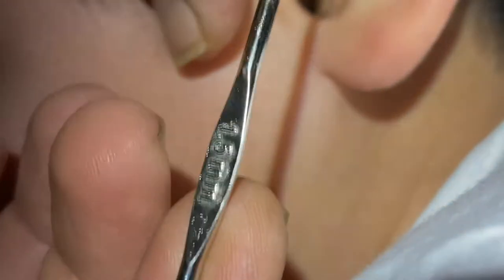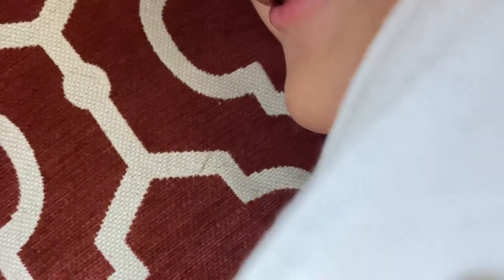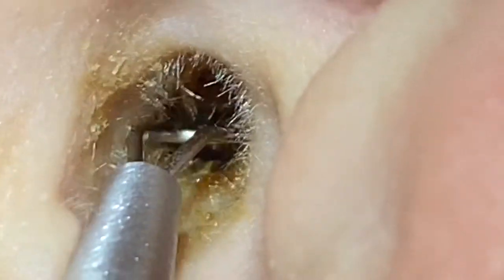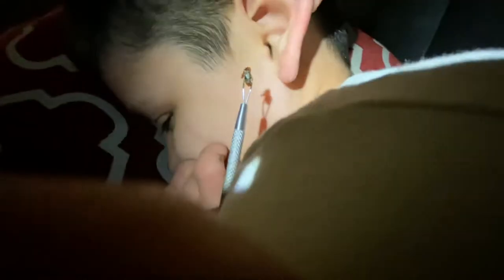Look at this, can I see? It looks like honey. What kind of stuff are we running through here? Hold on, I think this is a good tool for this because it's so soft — it doesn't even come off. Look at this, yep, getting it.